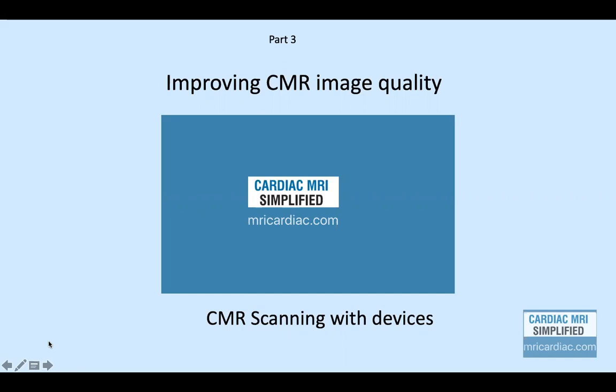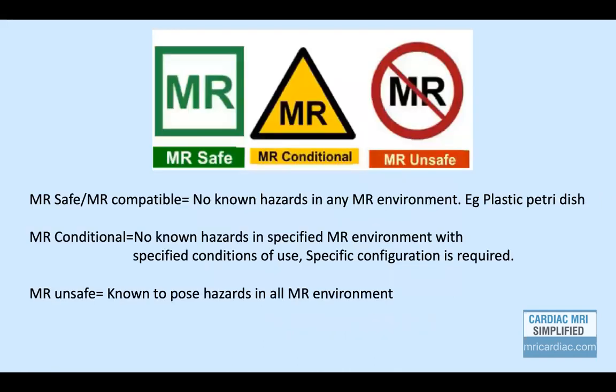Hello, welcome to MRIcardiac.com. This is the third topic in the series on improving CMR image quality, and today we will deal with CMR scanning with devices.